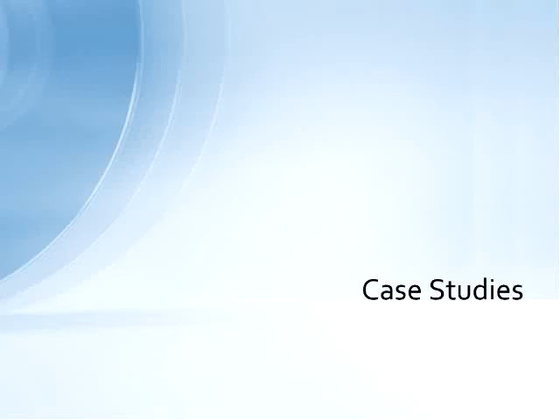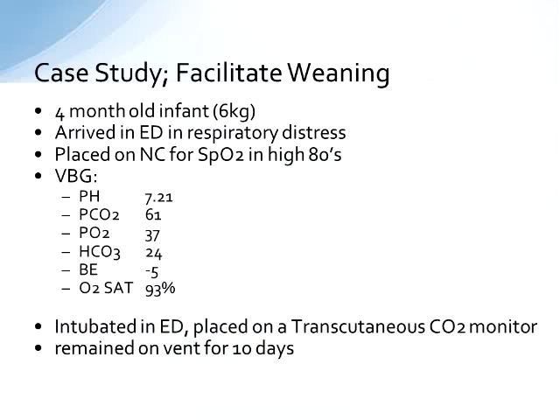So I want to go through a couple case studies. The first case study is about facilitation of weaning. These are real case studies that we saw in our pediatric intensive care unit. So this little angel is a 4-month-old, 6-kilogram kiddo who came into the ED suffering from respiratory distress. It was grunting, retracting, nasal flaring, febrile. So, diagnosed with pneumonia and respiratory failure. Started off on a nasal cannula, really could not oxygenate the patient.